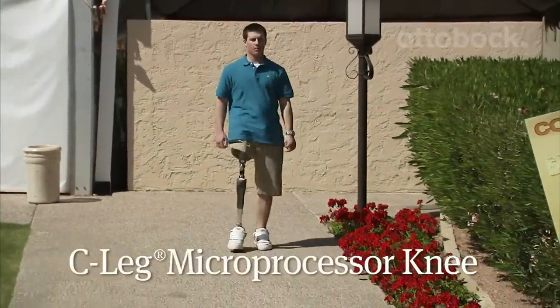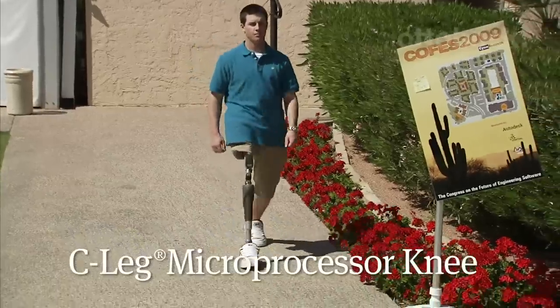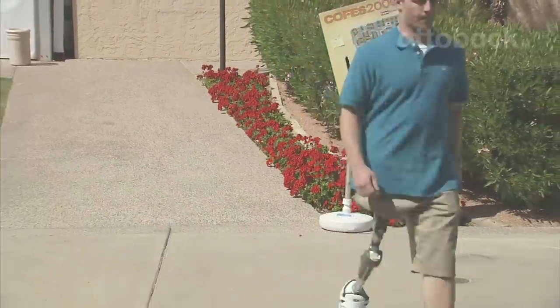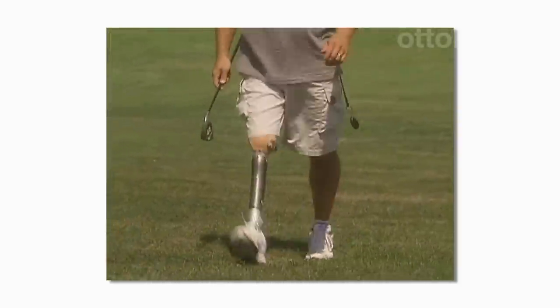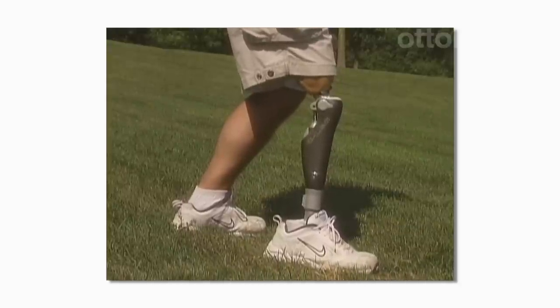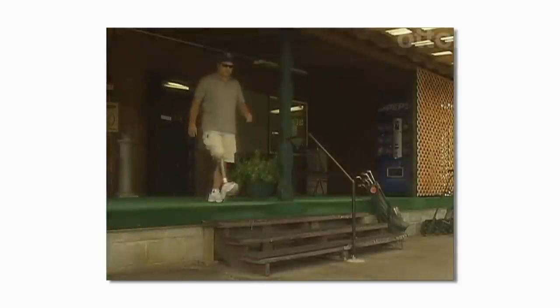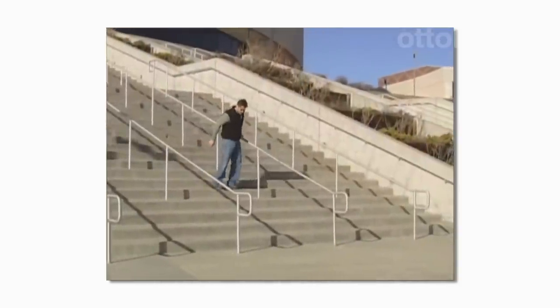Because the Helix is paired with the C-Leg microprocessor knee — the standard of care in prosthetic knees — you get the greatest security available. The revolutionary C-Leg technology has been the subject of more than 30 clinical studies. Those studies prove that no other prosthetic knee provides the same degree of confidence and security as C-Leg. The C-Leg is so remarkable that many users testify they no longer have to concentrate on every step to avoid falling. It even provides a unique stumble recovery feature.